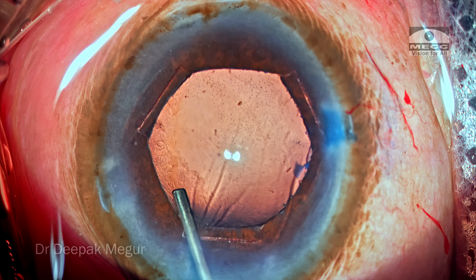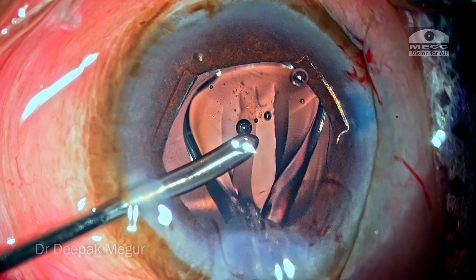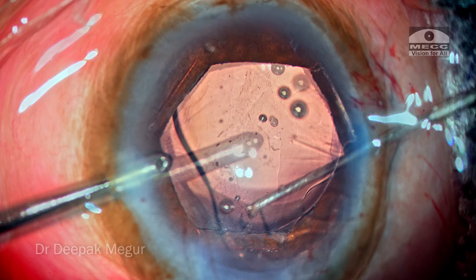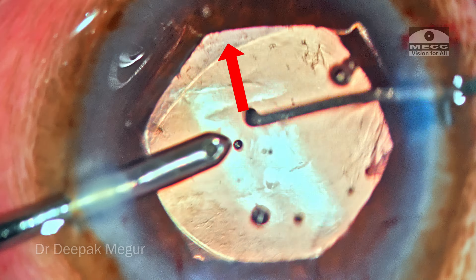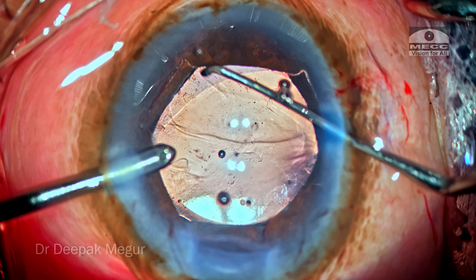The planned single-piece hydrophilic lens is being placed into the bag. I thought the job was done and it was time to close, but life has got surprises packed in. As I was nudging the lens into place, there was a momentary glimpse of a bare area beyond the capsular bag — that's unusual and it deserves a second look.